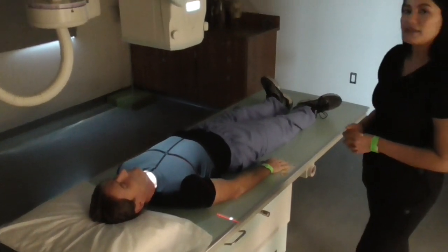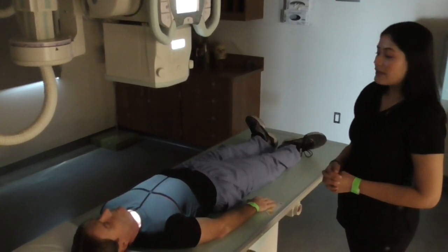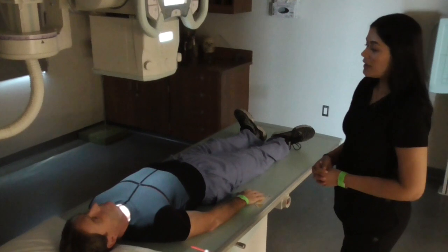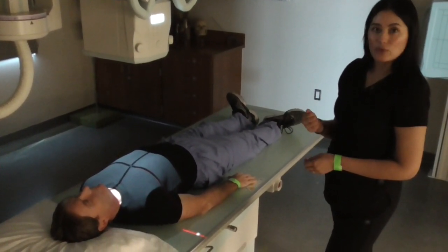So that is the AP supine chest. I would have him take a deep breath in, blow it out, take another big deep breath in and hold your breath, and I would expose.